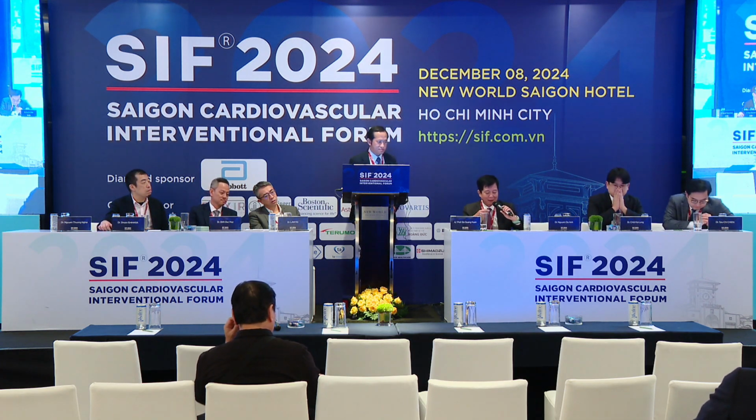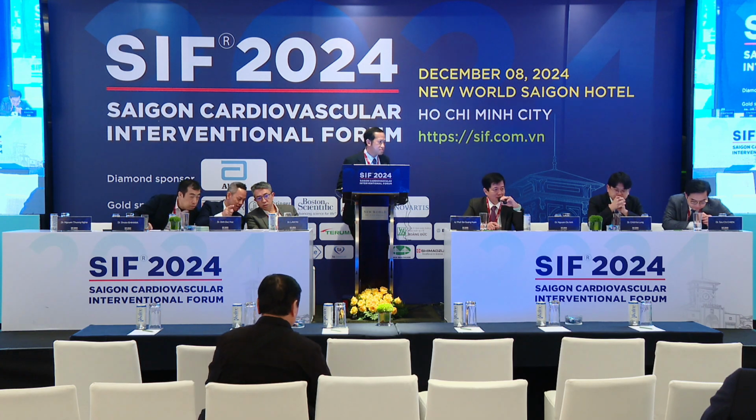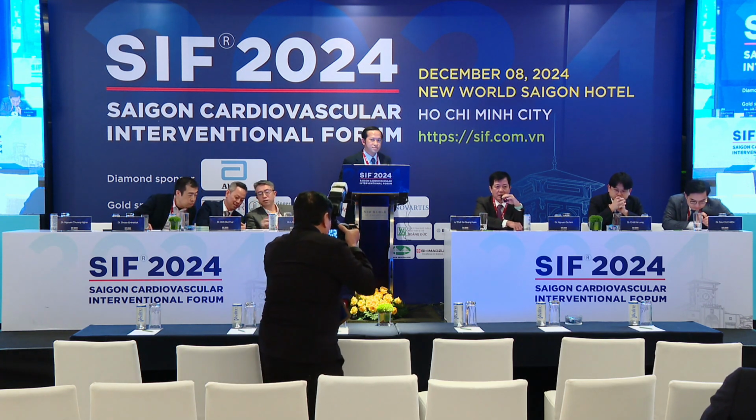For the balloon, when we do kissing balloon, it will provoke the dissection of the side branch. And you know that finally you should do the kissing balloon. If you do the dissection after you put the stent in the main branch, it is worse than if you do kissing at first. Do you do kissing at first?